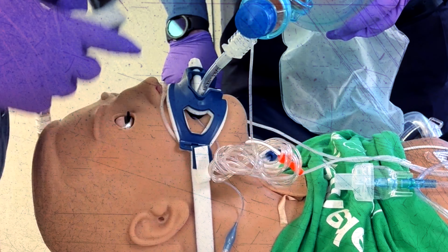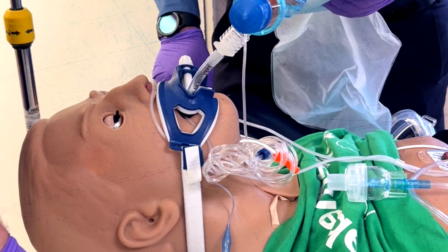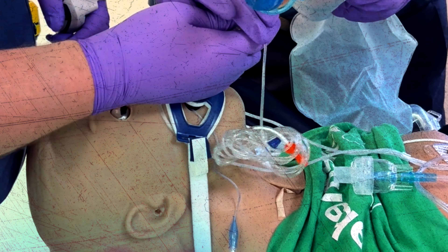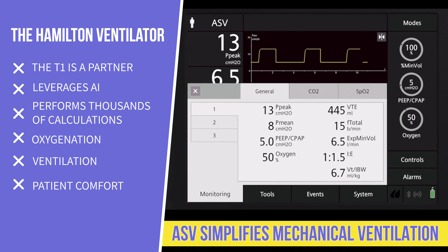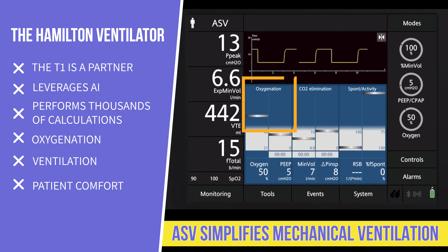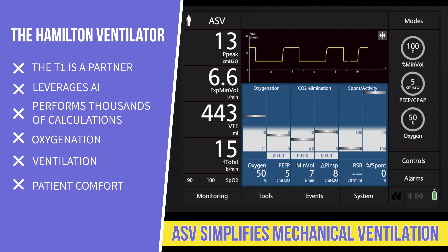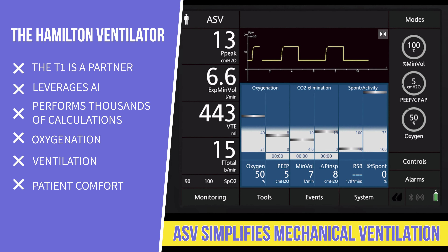Video laryngoscopy revolutionized endotracheal intubation. Similarly, the brilliance of adaptive support ventilation simplifies mechanical ventilation. The Hamilton T1, integrated with artificial intelligence, is not just a tool — it's a partner in your patient care journey. It leverages AI, performing thousands of calculations a second to optimize oxygenation, ventilation, and patient comfort breath by breath, becoming an exceptional teacher of ventilation principles.